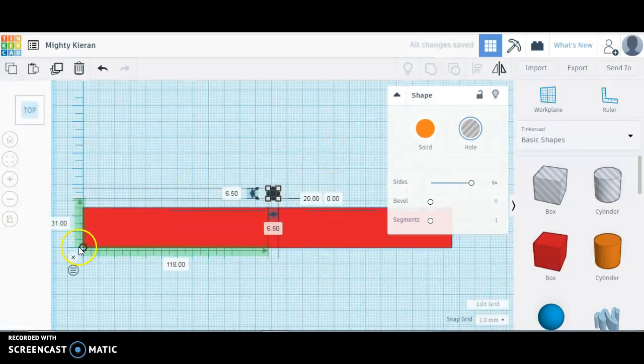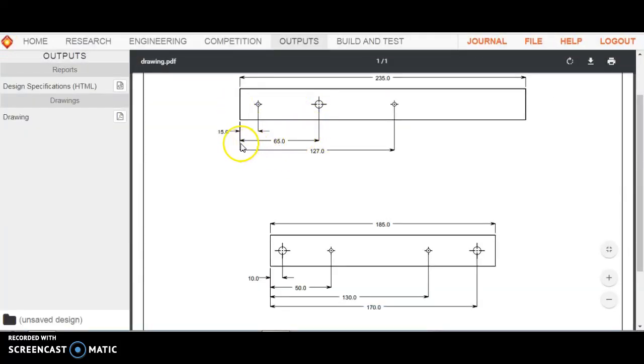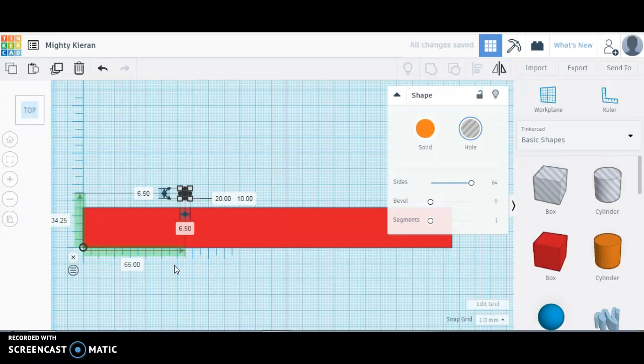Now, you notice with the ruler placed here, we're getting a measurement to the edges of this circle because the circle is selected. I want to change that to use midpoint. I don't want to measure to an edge of the circle. My measurements should be to the center as they are in the engineering drawing. So I see here this 1/4 inch hole is 65 millimeters from the center, and then it's pretty much right in the middle. So I would change this to 65, and this distance to the center of the circle should be half of 25 or 12.5 millimeters.